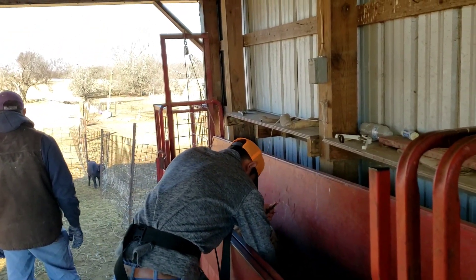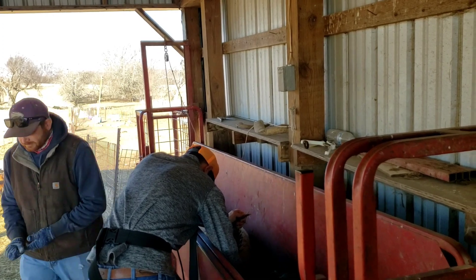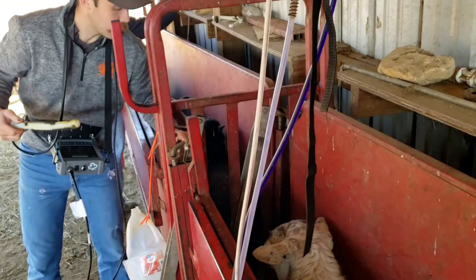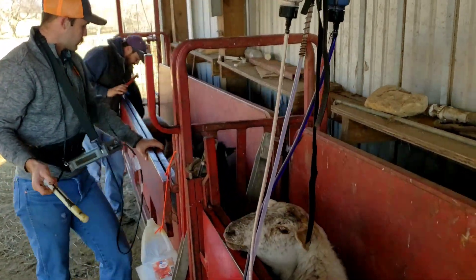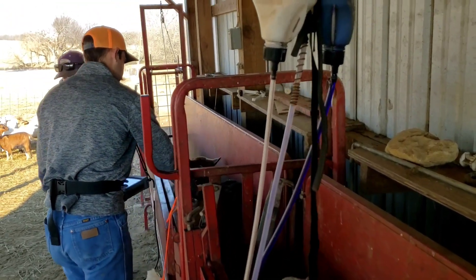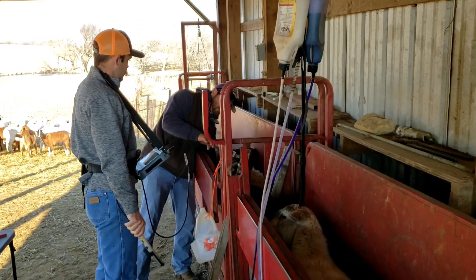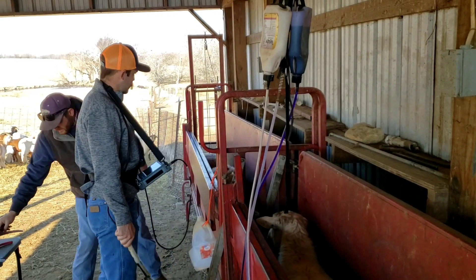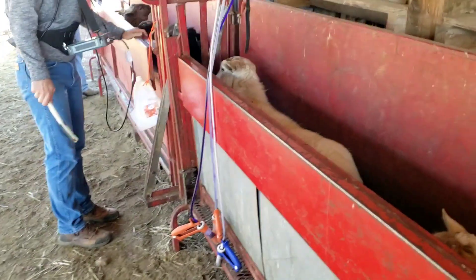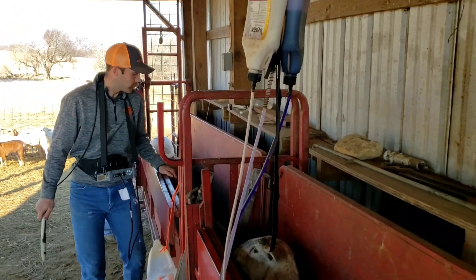If you know what you're looking for, it doesn't take very long - especially on the bred ones, you can see that pretty quick, within a few seconds. But if they suspect they're open, it takes more time just to make sure. The rectal probe is kind of easier for our working facilities. If you had the abdominal scanner you could sit down and scan under their belly, but this is working pretty well.